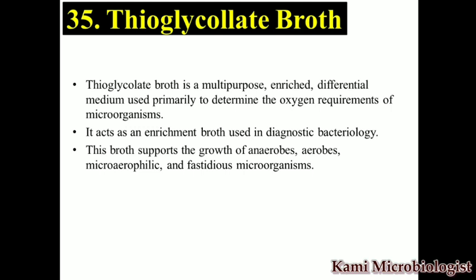Okay, now in this video we are going to see what thioglycollate broth is. Thioglycollate broth is again a culture media, which is multi-purpose. It is an enriched media, it is a differential media, and this type of media is especially important to find out the oxygen requirement needed for bacteria or microorganisms. This type of media is especially used in diagnostic bacteriology. Why? Because this type of media is an enriched media.